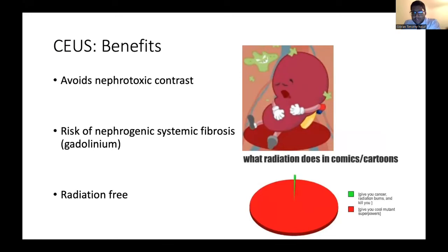not nephrotoxic. You do not have to check bloods before administering it. You haven't got the risk with gadolinium, which we are only now just finding out about. I know that there are recent reports of it being deposited lifelong in the bones and in pediatric brains. We are only going to find out the effects of this later on. So we still need to be quite judicious about how we use it. And as I said, it's radiation free.